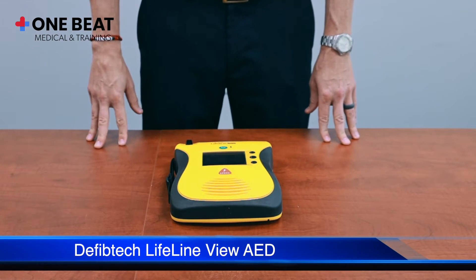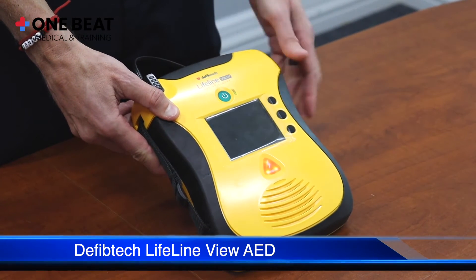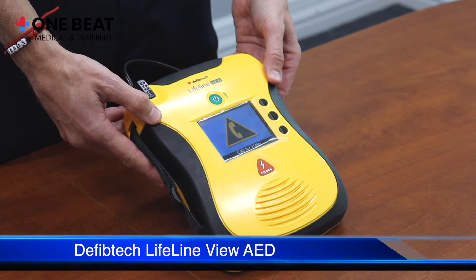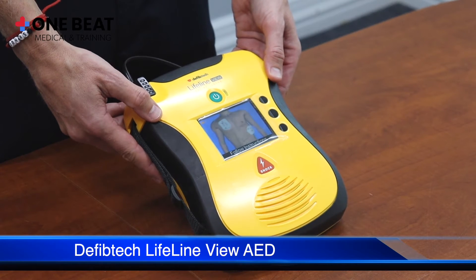To turn the machine on, you're going to use the on-off green button in the center top of the AED. The device will prompt: Call for help. Follow instructions to apply pads.